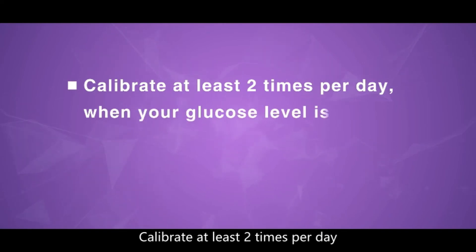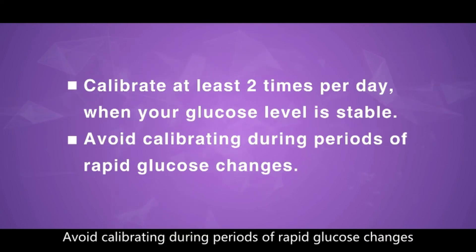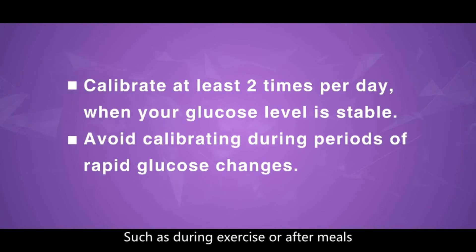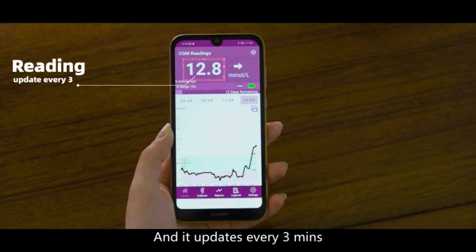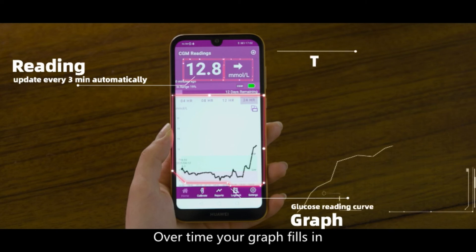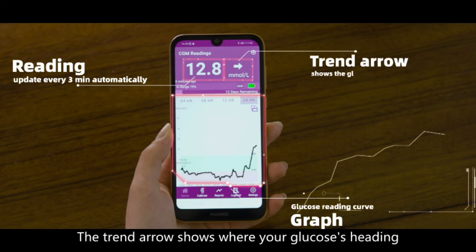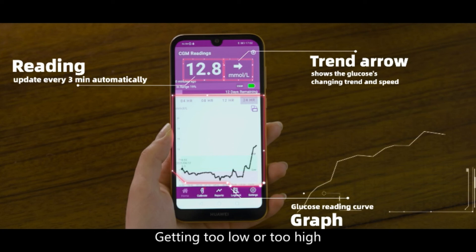Calibrate at least two times per day when your glucose level is stable. Avoid calibrating during periods of rapid glucose changes, such as during exercise or after meals. You get your glucose reading on the home page and it updates every three minutes. Over time, your graph fills in. The trend arrow shows where your glucose is heading and how fast it's moving.